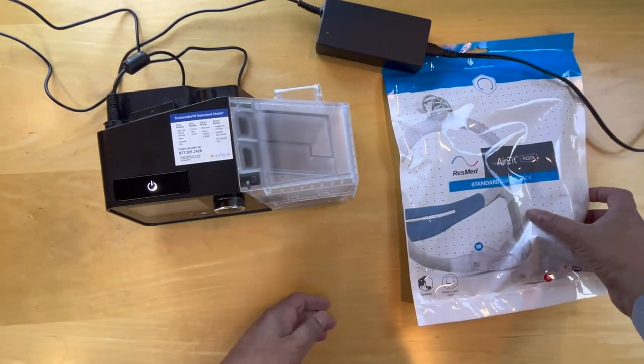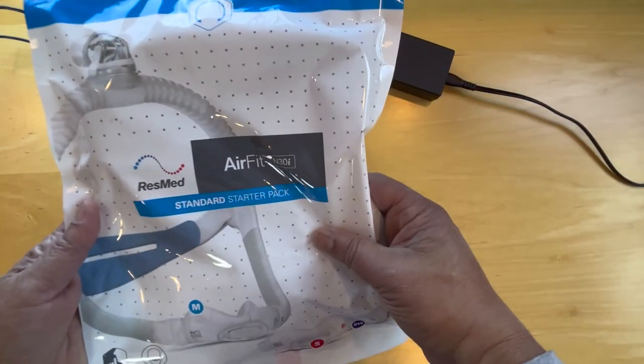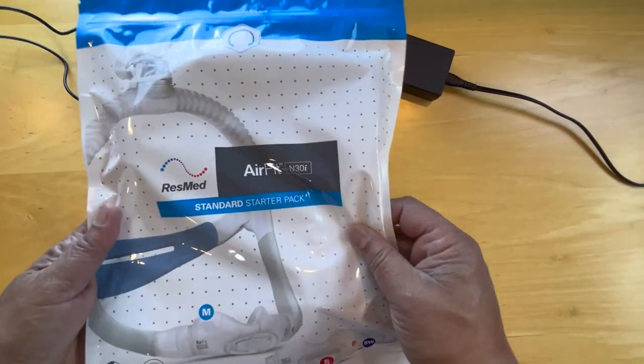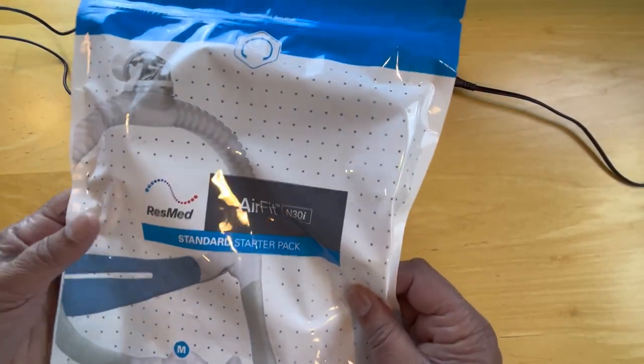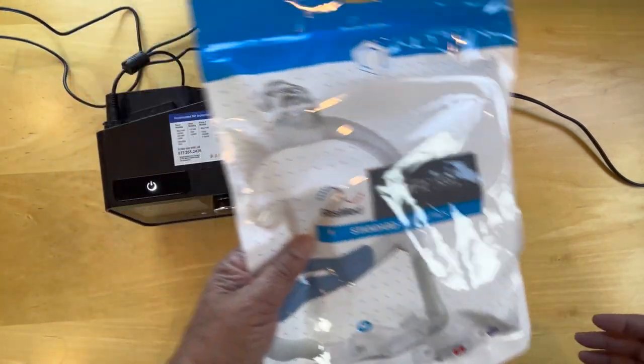And then we have a hose pack. So let's open this and we'll be right back.